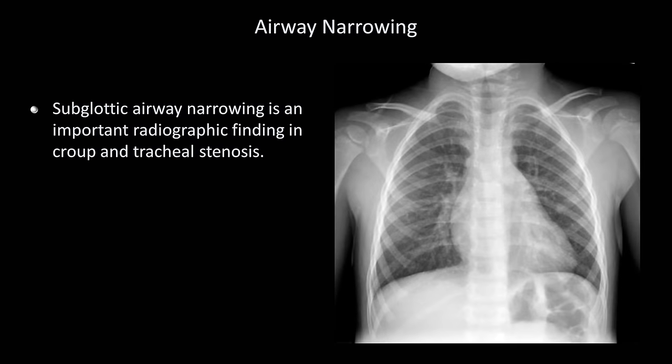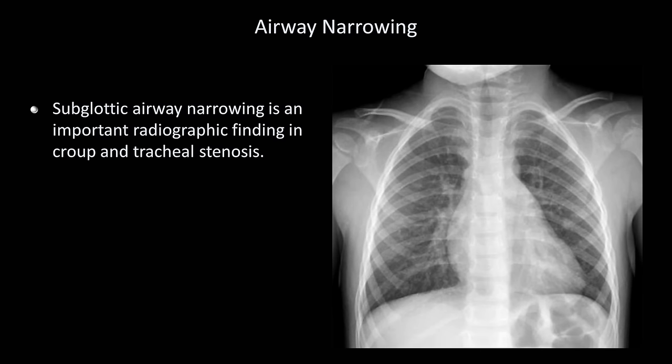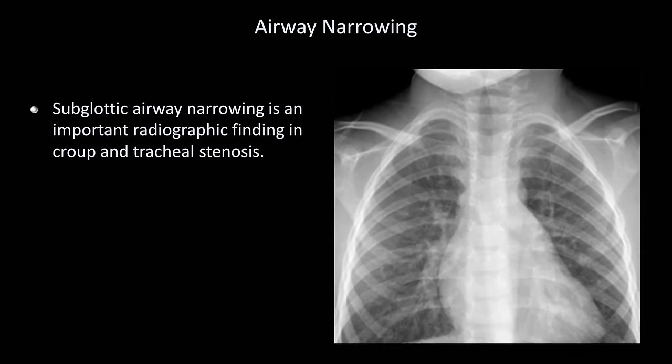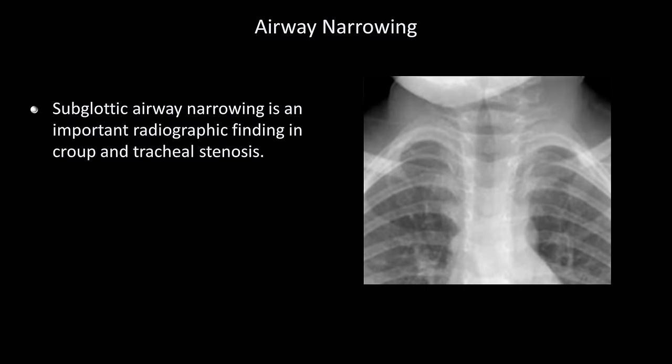Here's an example of a three-year-old boy with several days of cough and fever. If we zoom in on the upper airway, you can see how the airway gets nearly pinched off near the very top of the film. This is sometimes referred to as the steeple sign, because the airway ends up looking a bit like the steeple of a church.